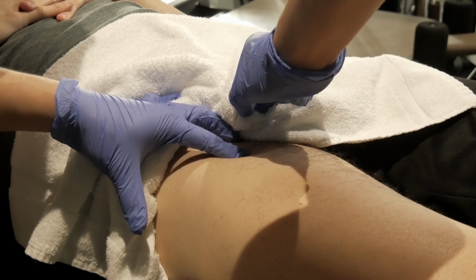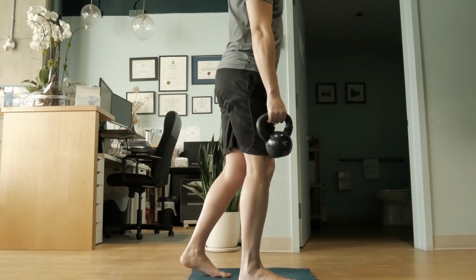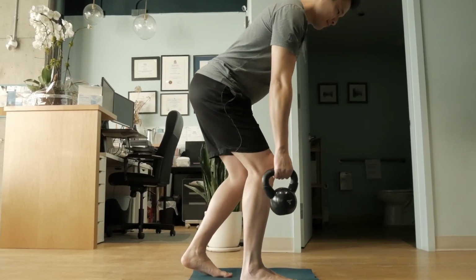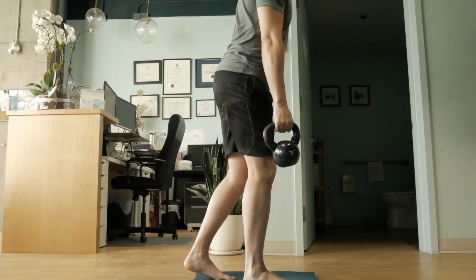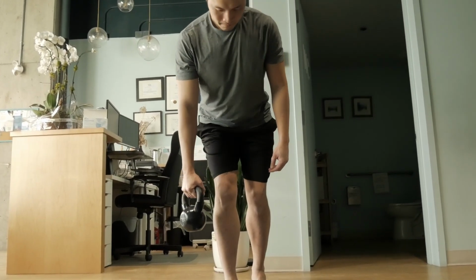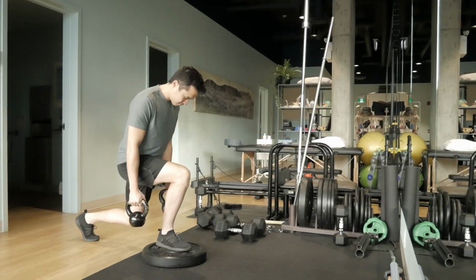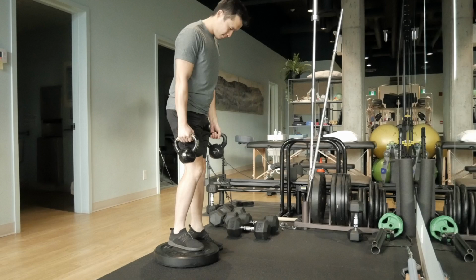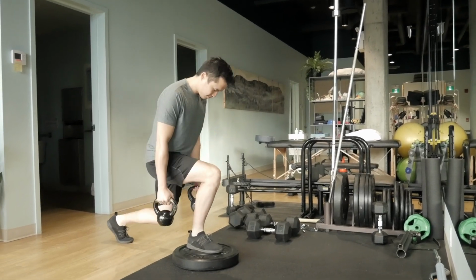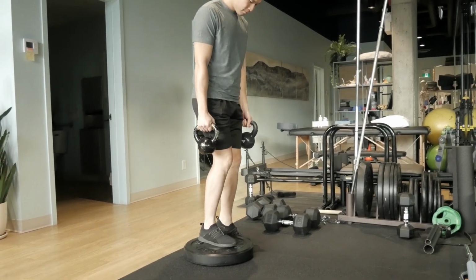Let's go back to our example where I needled the iliopsoas muscle. If the head of the femur is seating better in the socket after needling, it should allow different muscles such as the glute max to recruit. Recruiting and ultimately hypertrophying the glute max muscle can reciprocally inhibit the hip flexors, resulting in less activity of the hip flexors with enough practice. Here, we're using a reverse lunge task with the front foot elevated to encourage the femur to glide as far back into the socket as it can.